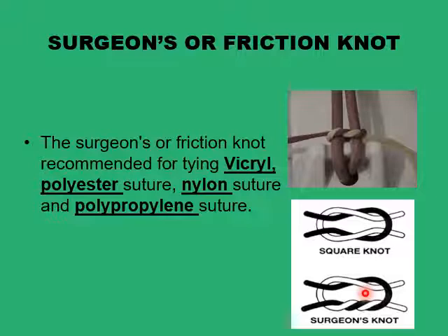So if you are using synthetic materials, you don't want the tension in the half reef knot to loosen before you apply the second half reef knot, and for this you wrap the suture twice before you start doing the other half reef knot. This adds to the friction and the security of the first half reef knot, particularly with synthetic material.